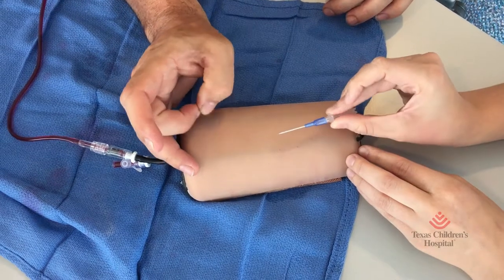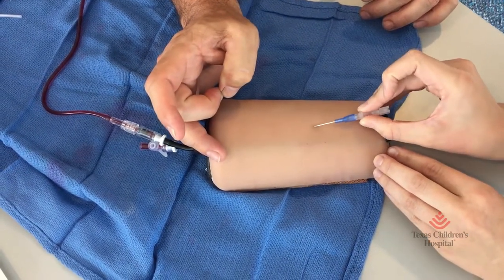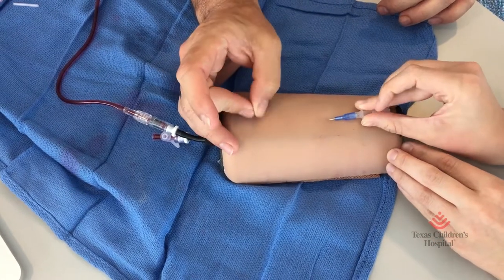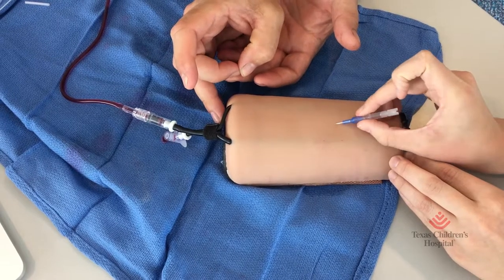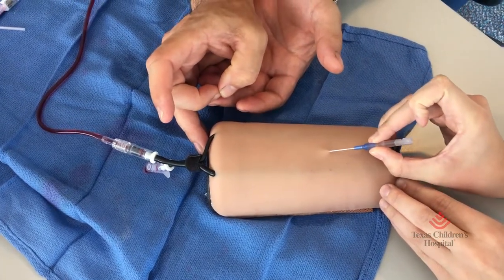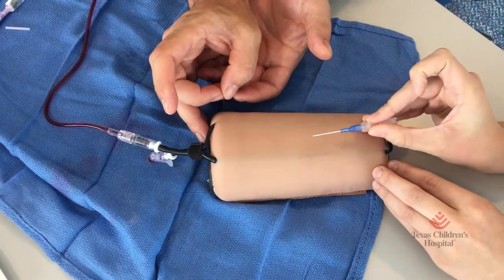Go on in. Don't drop it. Do you see the flash? There you go. I'm using these muscles which are the most exterior muscles you use in your body. So if you need two hands, it's fine. Then slide it off and slide it down all the way.